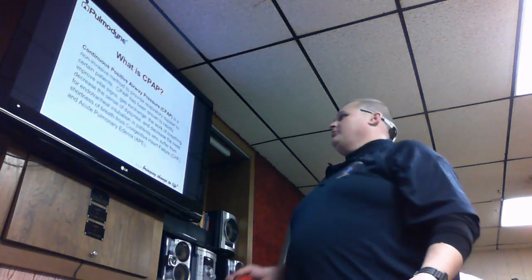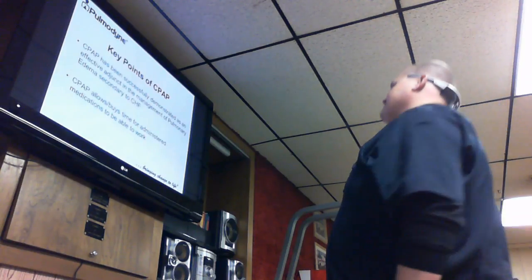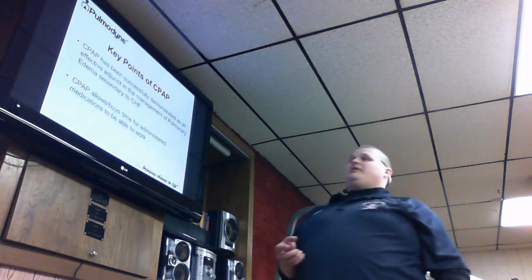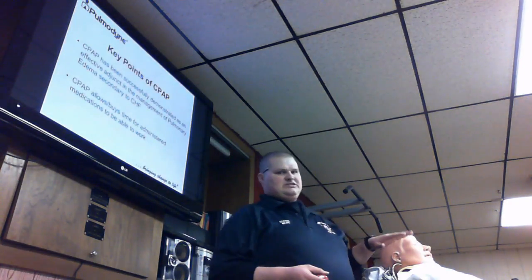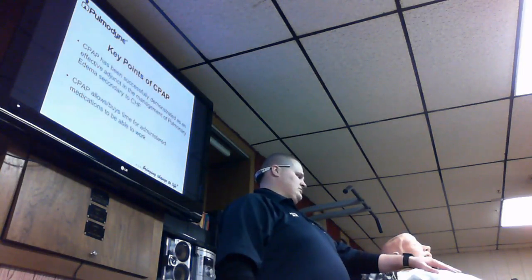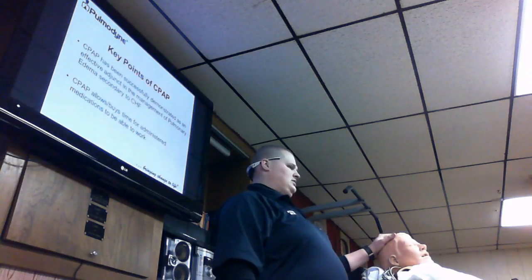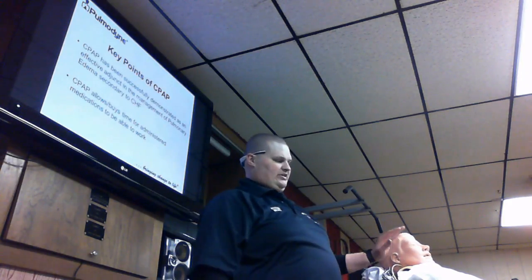So moving forward again, CPAP has been successfully demonstrated as an effective adjunct for management of pulmonary edema secondary to congestive heart failure. What CPAP does is buy time for administration of other drugs. You'll find out with Captain Lance here that when we get working and securing the patient, he'll actually improve his breathing and stuff like that.